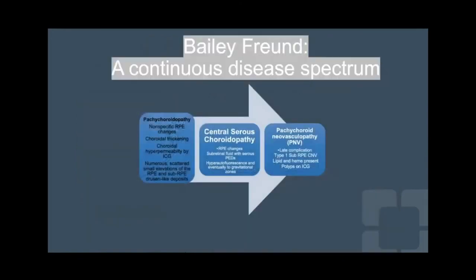And Bailey Freund put this out, which shows you again the spectrum between pachychoroidopathy to central serous to pachychoroid neovasculopathy, which is the end stage form of what we showed here, where you get neovascularization present alongside CSR.